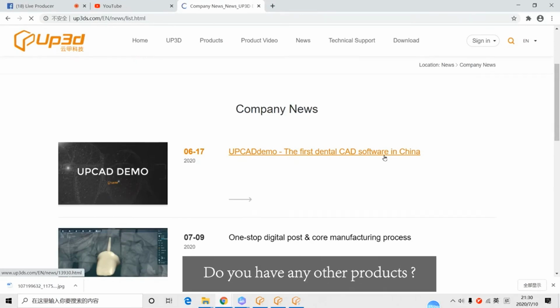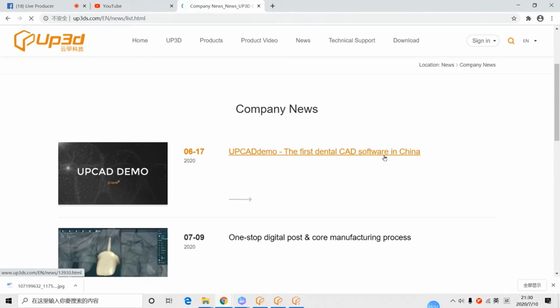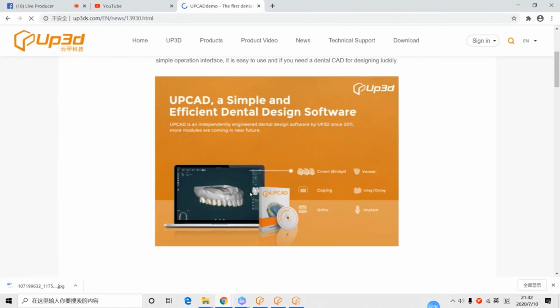Oh yeah, Miss Liana, we do have other products. We have desktop scanners and dry milling machines for zirconia and PMMA wax. We're selling very well around the world. We sold around 2,000 scanners last year and 500 milling machines last year around the world. And we are developing new products like an intraoral scanner and a wet milling machine. It's on the way, so we are a company with a lot of potential to develop. Is there any other questions you guys want to ask so I can be sure to answer them?